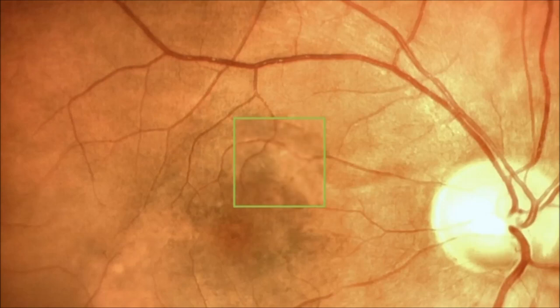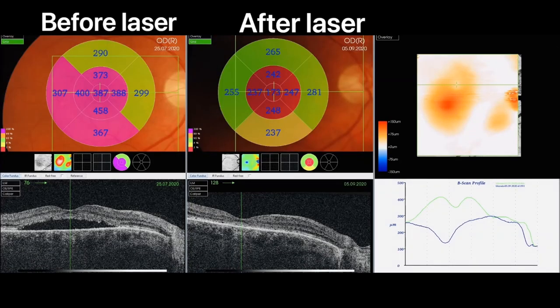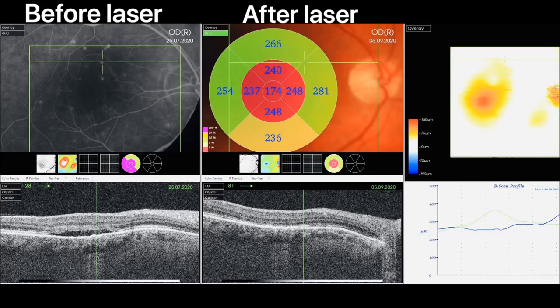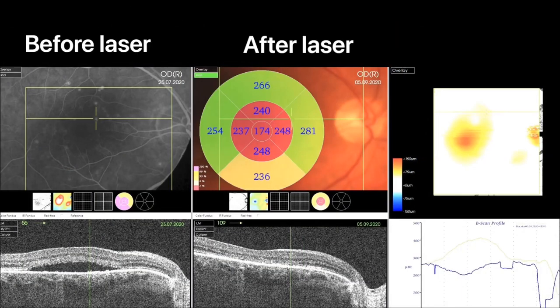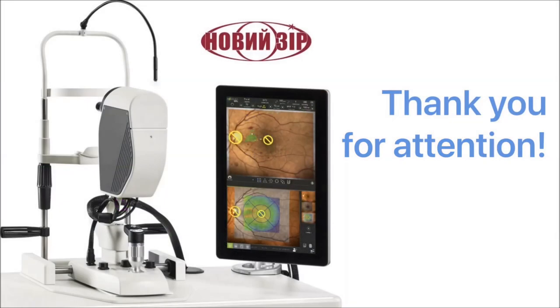It is advisable to warn the patient to fixate their gaze on the external fixation light and not move their eyes during treatment, which usually takes less than one minute. Here are the OCT B-scan images with maps of retinal thickness presented before and 42 days after focal laser treatment. Pinpoint registration of images before and after with fluorescein angiography overlay allows control of subretinal fluid resorption at every point of leakage that was treated.